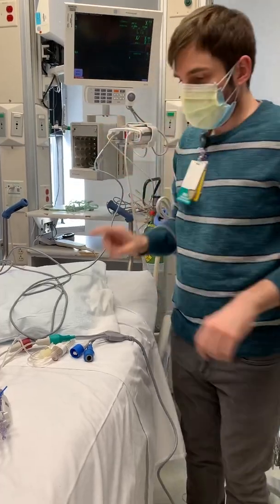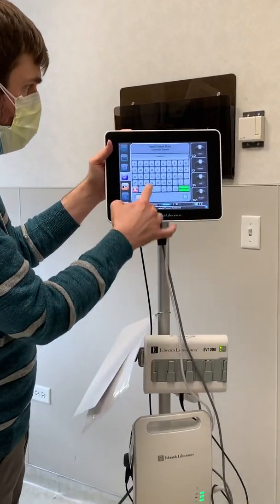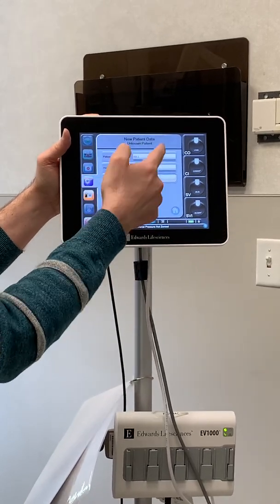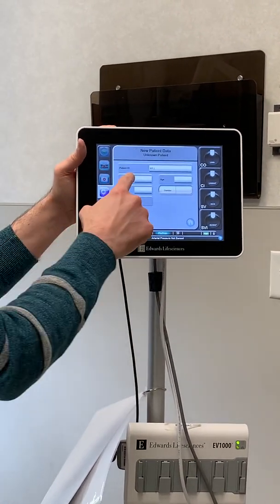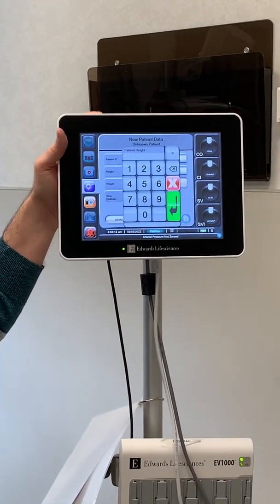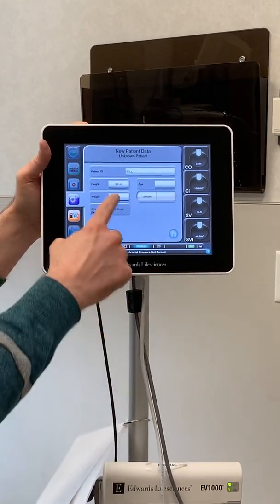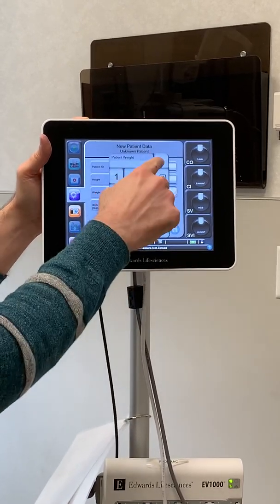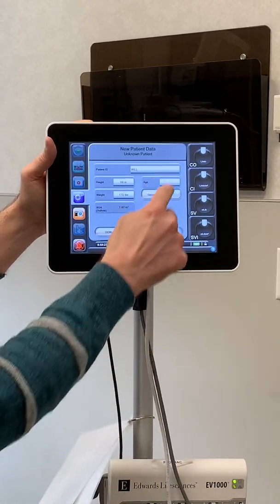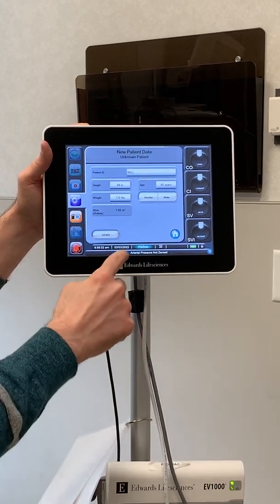Now we're sending the information to two different places. Next, you've just got to put in some kind of a patient ID. I don't think it really matters because we're not sending this information into Epic or anywhere — we're just looking at it. We do need to put in the height and weight because it's going to do cardiac calculations based on the patient's height and weight. So, inches — 5 foot 9, 170 pounds. You can do pounds or kilos by clicking the button up there. Age, gender, and then hit home.